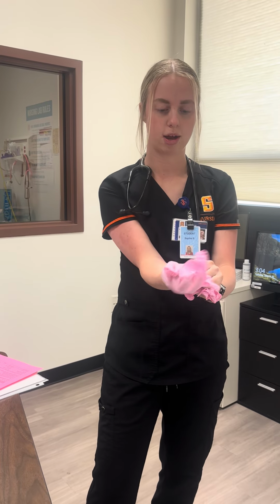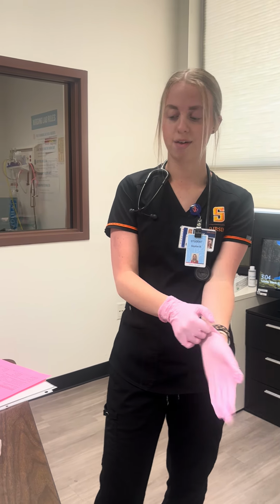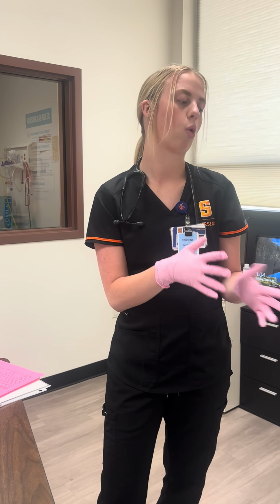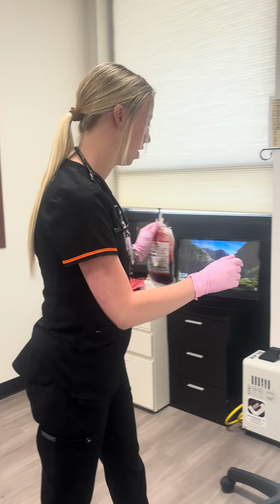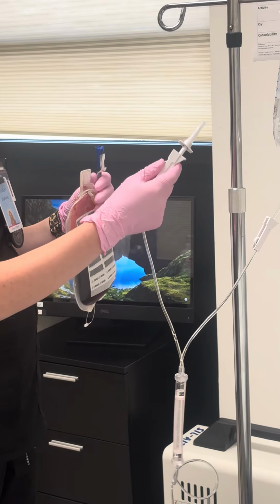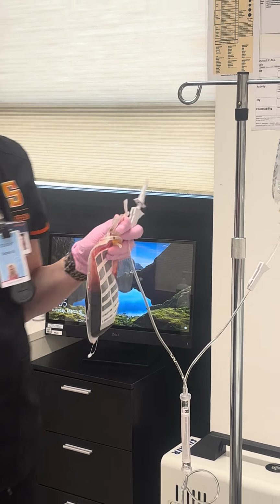Okay, I am going to put gloves on again. Now that we have the blood, we need to make sure that we administer the blood within 4 hours, or we will have problems. So we want to ensure that that has been stated and recognized before administering. I'm now going to grab my second thing. I'm going to ensure it was already clamped. And I'm going to spike my bag.